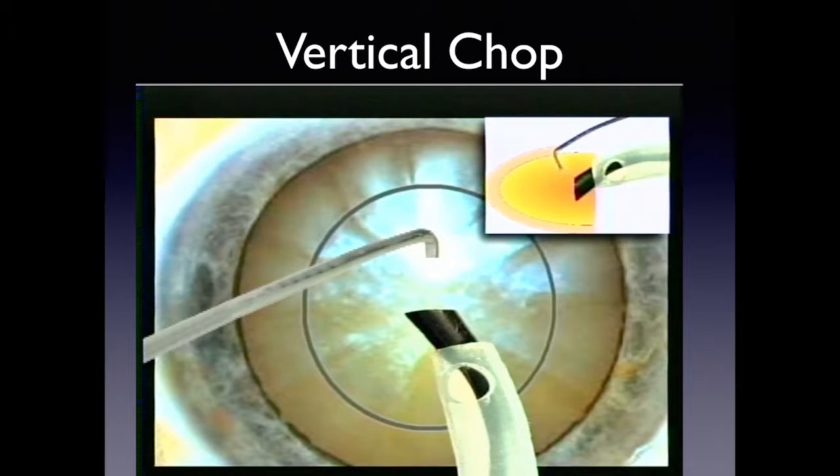In a vertical chop, which is my favorite, the chopper goes straight down. A Nagahara chopper has a soft bottom so it doesn't work great in hard nuclei, but it's safe in 2 to 4 plus. You must bury the tip, allow it to occlude, then slowly come off the phaco handpiece and don't move it. A common mistake beginners make is staying in foot position three while backing their hand up — that pushes off the nuclear piece and you lose occlusion, so you can't chop. You lose control entirely.